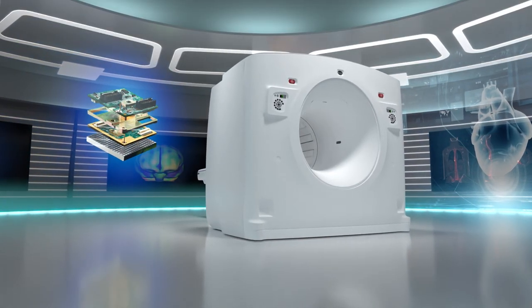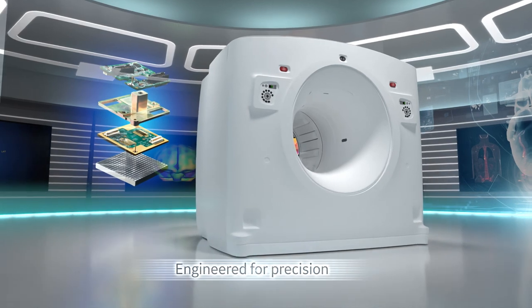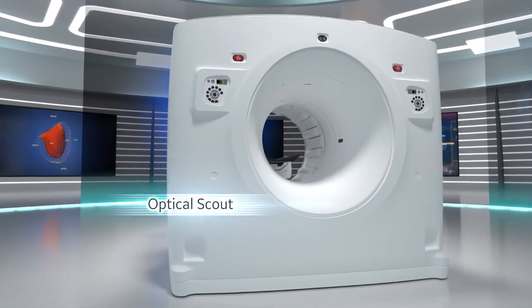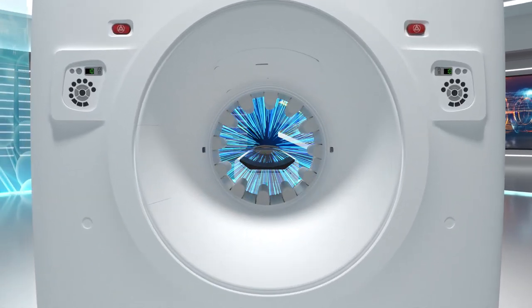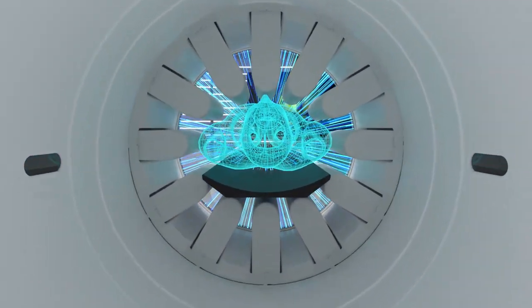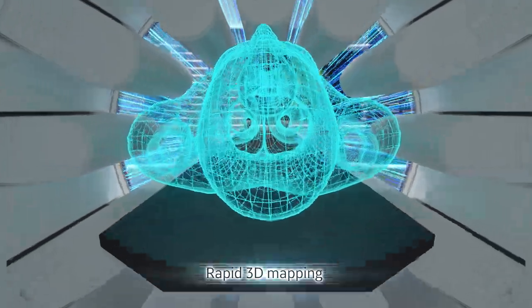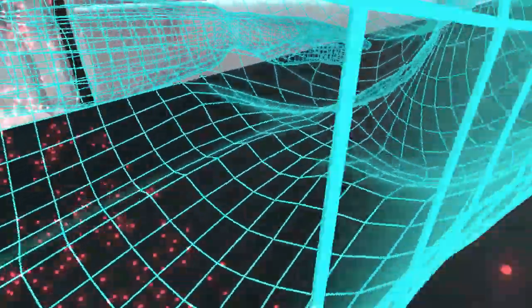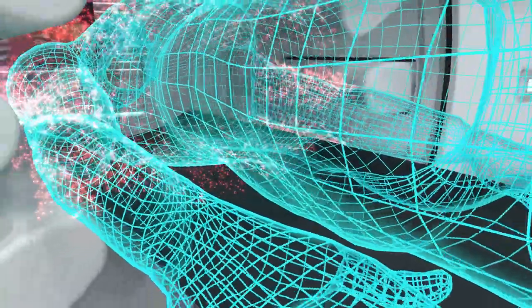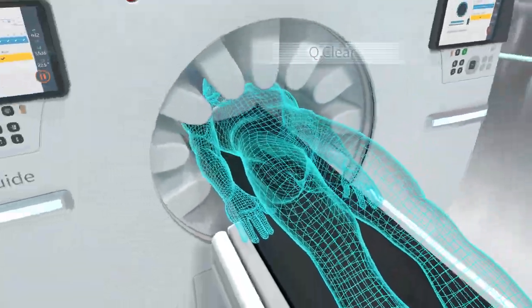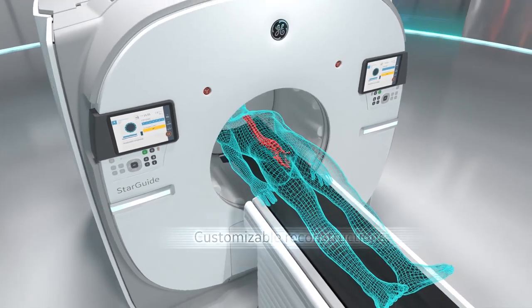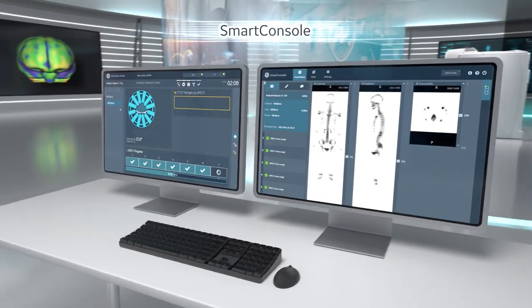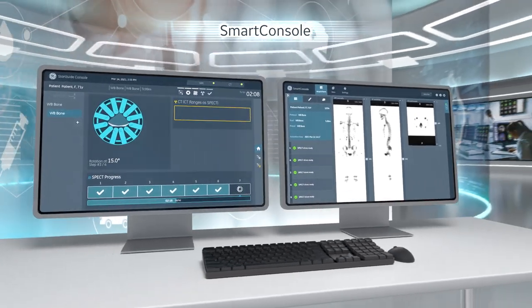Powered by breakthrough technology and engineered for precision, Optical Scout enables predictably fast workflows with reliable image quality. Along with rapid 3D mapping, StarGuide efficiently processes 3D imaging data, aids fast acquisition with QClear and enables customization of recon protocols. SmartConsole automates volumetric reconstructions.